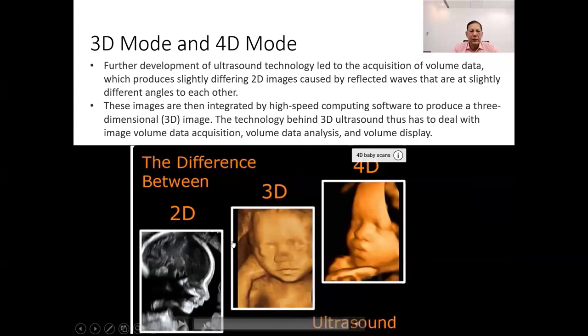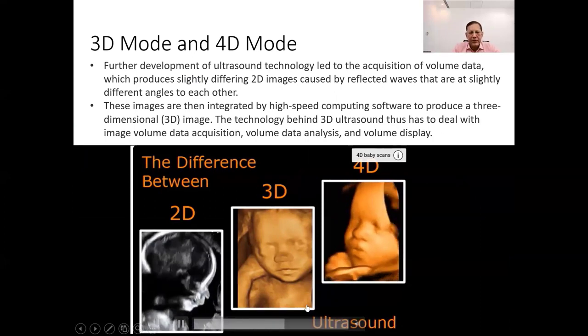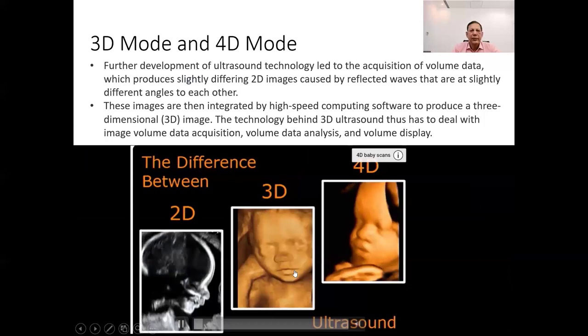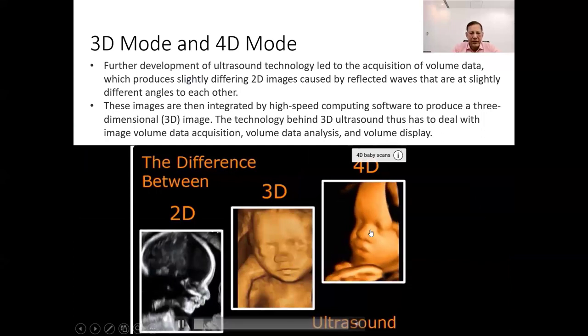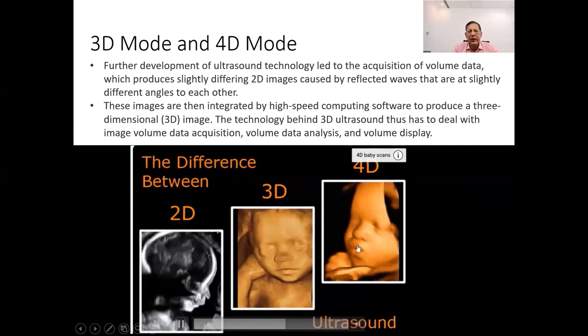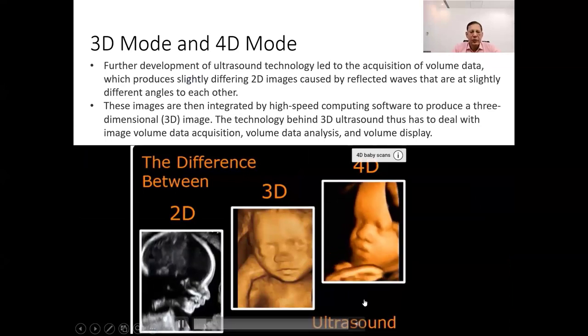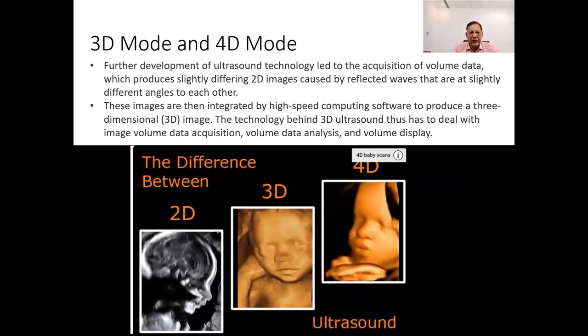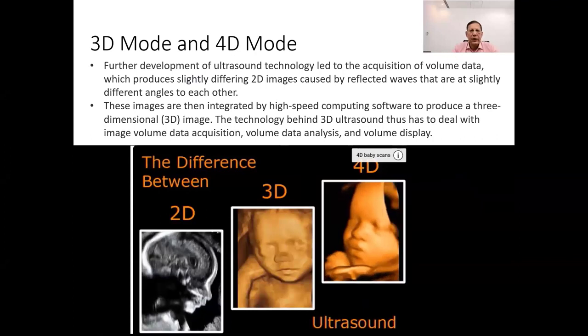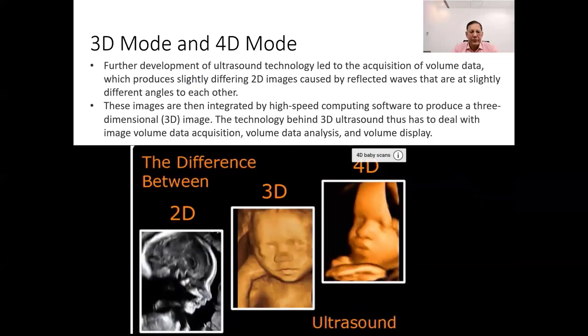3D mode creates three-dimensional images of the scanned area. 3D mode combines multiple B mode images to generate a volumetric image. It is used especially for fetal imaging and anatomical structure evaluation. 4D mode is real-time three-dimensional imaging, often referred to as live 3D. It adds the dimension of time to 3D imaging, providing live-action views, applied especially in obstetric imaging to observe fetal movements.